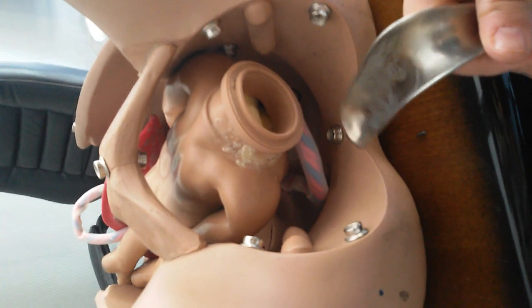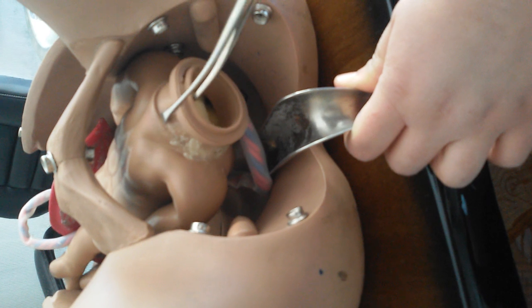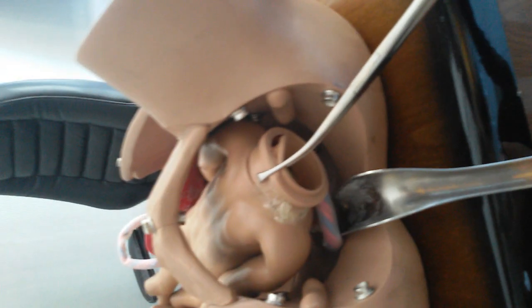We use the speculum for opening the vagina — we put it in this direction and we can now visualize the cervix. The assistant will then apply some antiseptic spirit, and we use the tenaculum over the cervix to grasp the upper lip of the cervix and pull it to visualize it better.